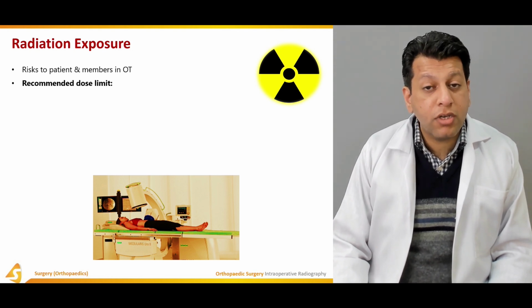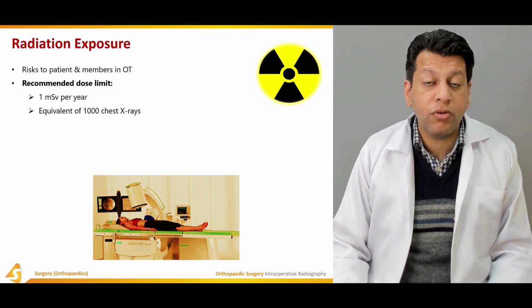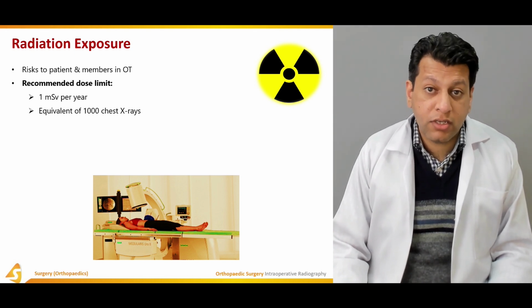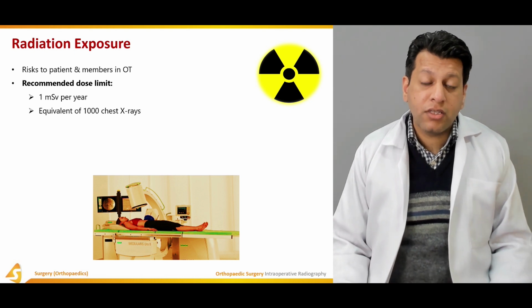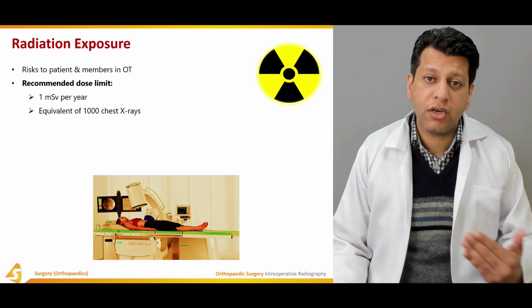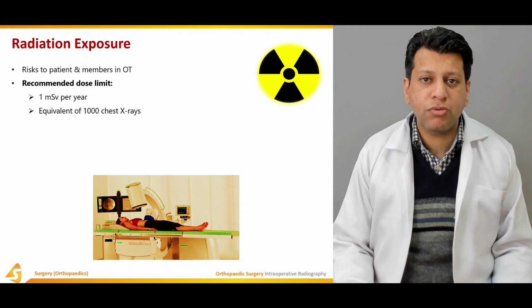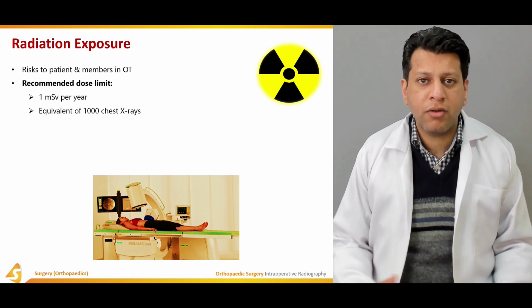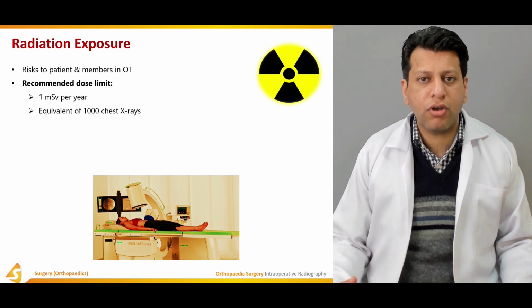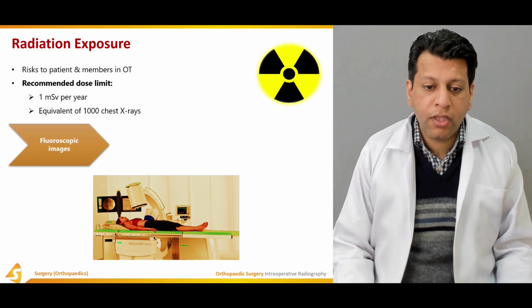The recommended dose limit for radiography is usually 1 millisievert per year. That is equivalent to 1000 chest x-rays. So you can well imagine there is a lot of debate going on that, instead of decreasing the exposure, what we can do is use protection so that surgeons can perform longer surgeries for a longer period of time, for a longer duration of the year.